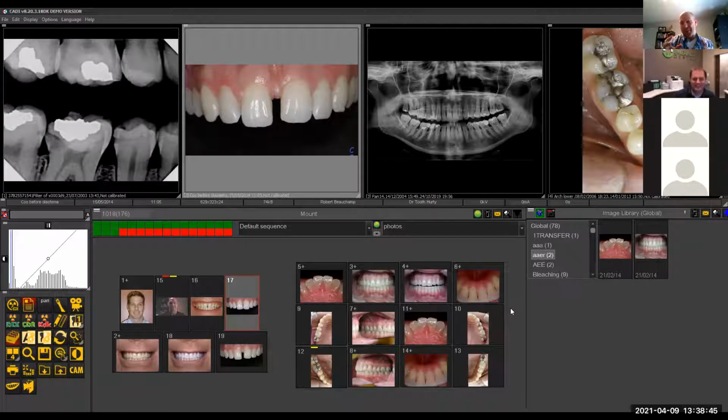You're going to take so many pictures, and you're going to be prepared to save those original files, because you're going to be working on that over and over and over, and those wax ups and those wax ups. And so, I mean, you're going to want it to be perfect, right? So this system works awesome.